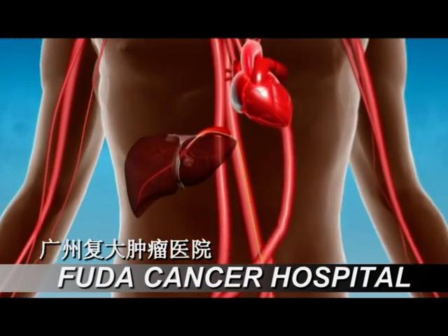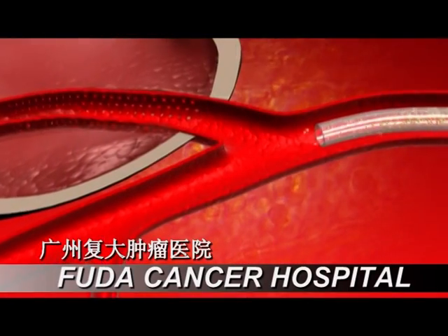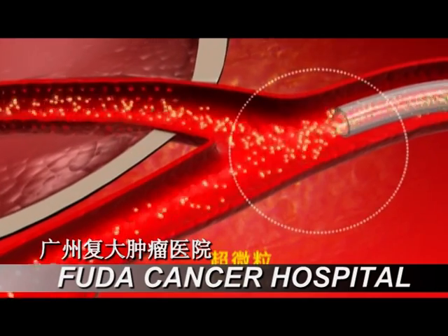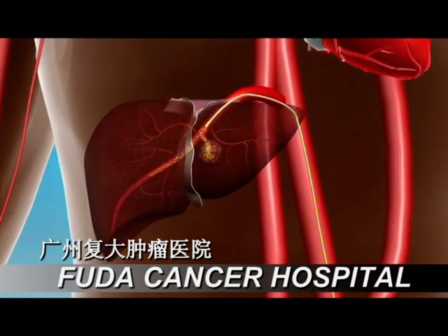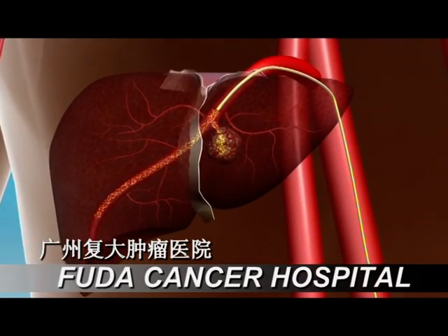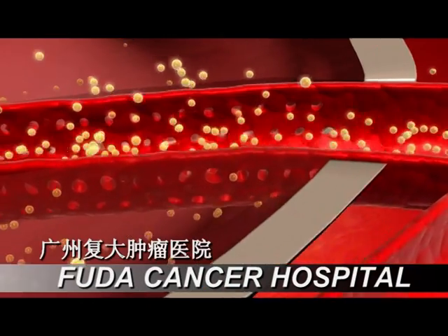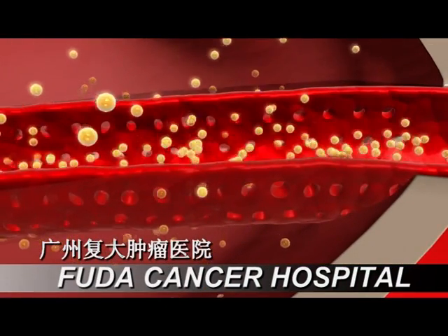Ultramicron drug particles are injected into the front part of the catheter, where the capillaries that provide blood supply to the tumor are adjacent. Some parts of the drug would be removed out of the human body through normal blood vessels, whereas others would be leaked into the tumor tissues through the interspaces of the tumor blood vessels.